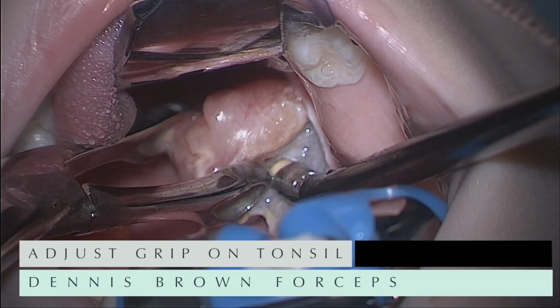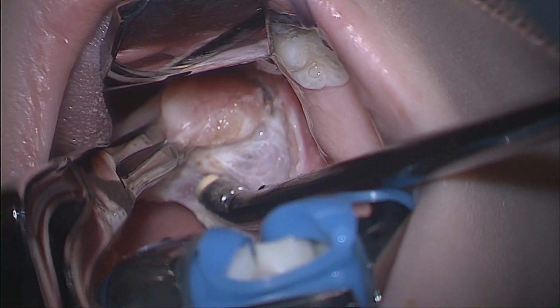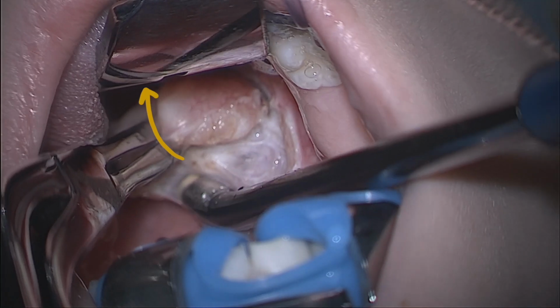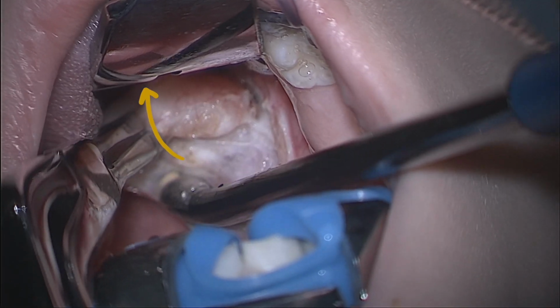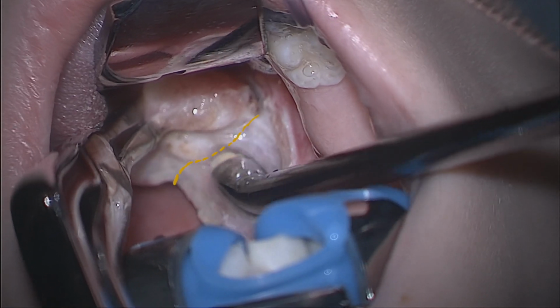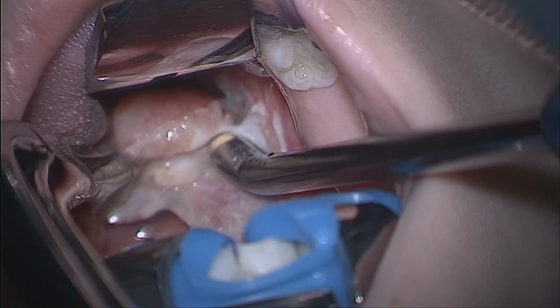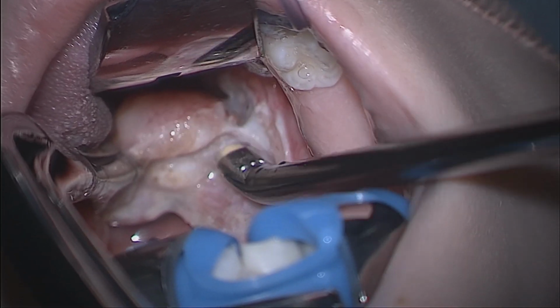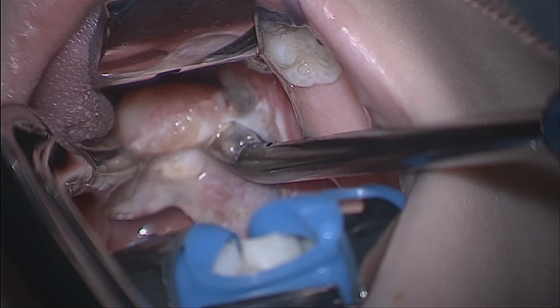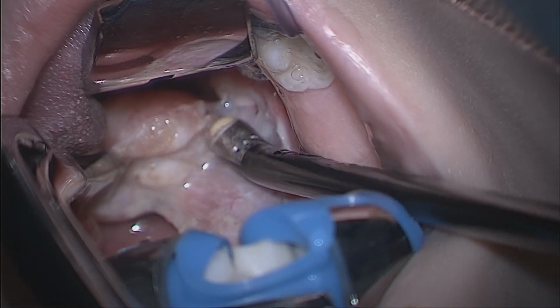Once the superior pole has been released, the tonsil is re-grasped at the superior pole, with traction applied to the tonsil medially and inferiorly. This helps to demonstrate the correct plane of dissection. As the wand of the coblator is consistently directed towards the capsule of the tonsil, this helps to ensure that the surgeon remains within the correct plane, while minimizing the thermal action on the underlying muscular fibers.